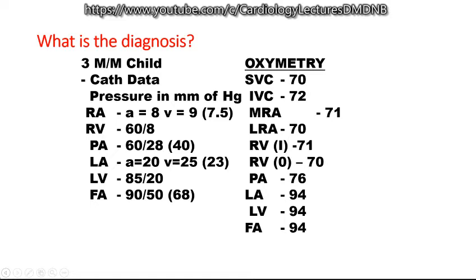One is the position: the left atrium lies between the spine and the RA, and RA is more compliant compared to the LA, sir. The reasons are that we have pulmonary veins draining and the spine posteriorly, so distension will be less in the LA, sir, compared to the RA.